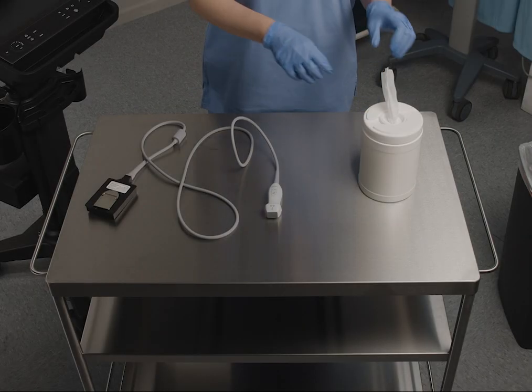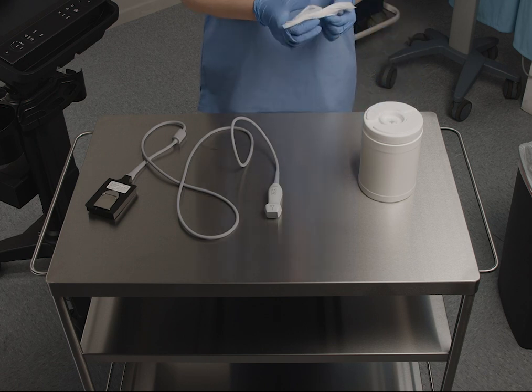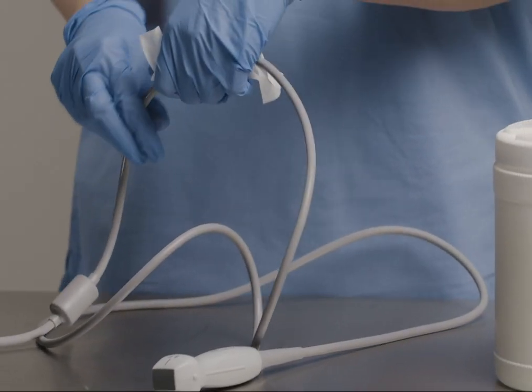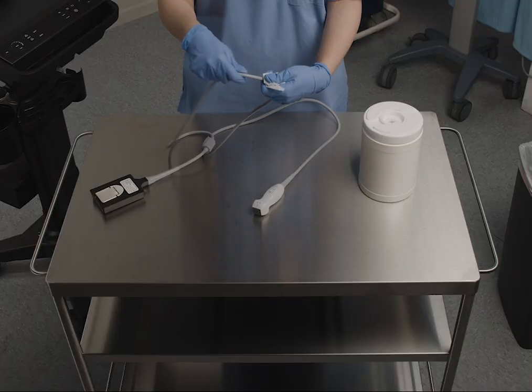Next, let's clean and disinfect the transducer, which was used on unbroken skin with no blood or bodily fluids. With a pre-moistened wipe, starting from the cord, wipe downward toward the scan head, removing gel or other debris.